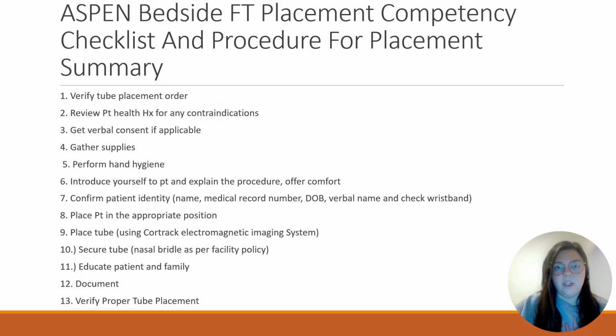There are various ways you can secure a feeding tube, in this case, a nasal bridle, as per the facility policy. You should educate the patient and family on what is going on during the process, if applicable, but also on care for the feeding tube and what to expect. Document as per hospital policy, and then you should verify the proper tube placement.